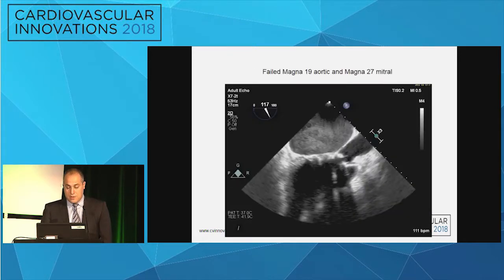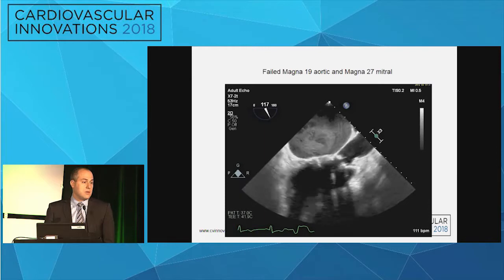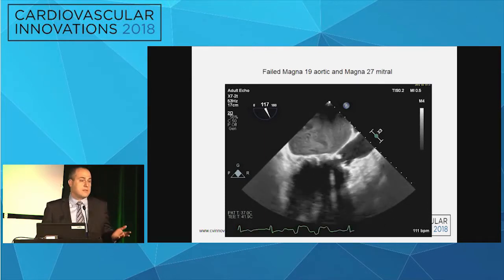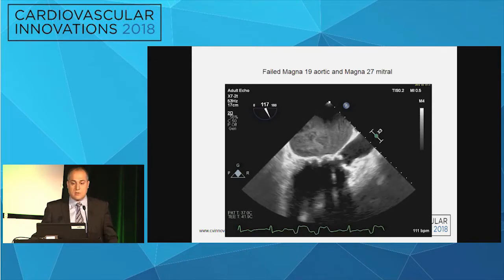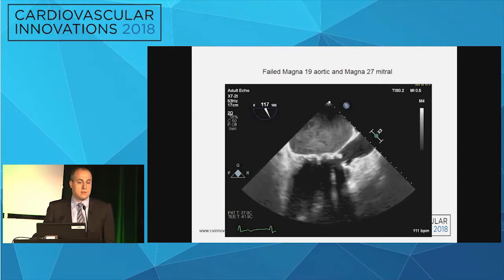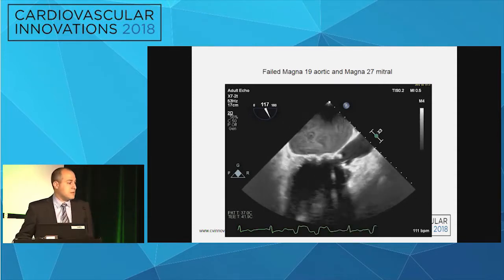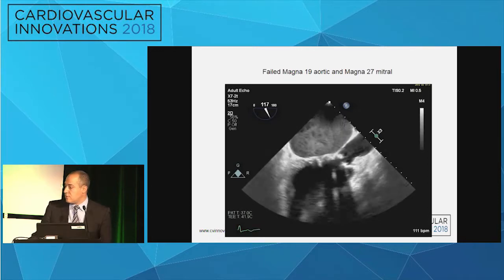So I'll be happy if we can stop for a second and talk about the sequence. What do we do? She has mitral, aortic issues. What should be first? She's here for transcatheter treatment. There is no other approach. She's also high risk for coronary obstruction with aortic valve involved. Should we target the aortic first, the mitral first? What do we do with the risk for coronary obstruction? I'll open up for discussion.